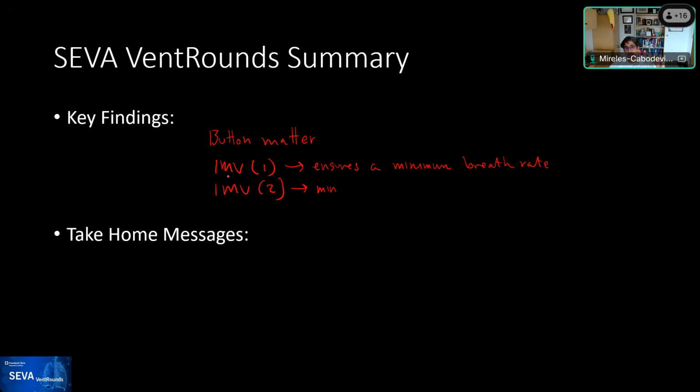You can also think about IMV 1, and we have used this in patients that have a very poor, we cannot use the airway signal to ventilate them. So patients that had huge leaks, by putting them on IMV type 1, you negate the trigger, and they will get the mandatory rate, and then it takes away the craziness of other ones. So you just put the pressure support at 0, and they will get the CPAP, and then they will get their mandatory breath. So that's another way that IMV type 1 may save you from some very challenging situations.